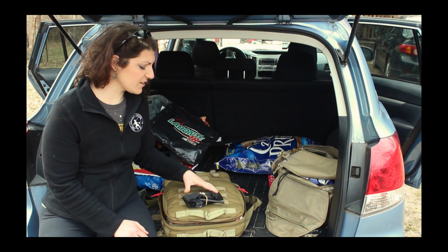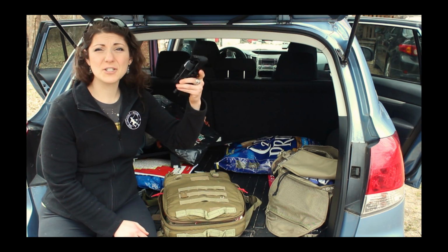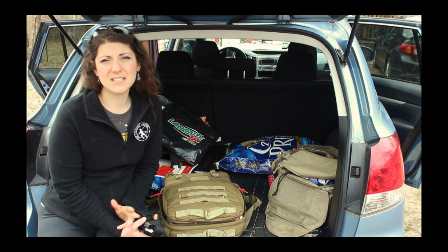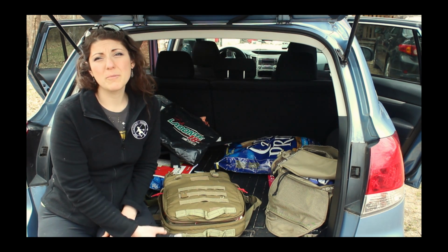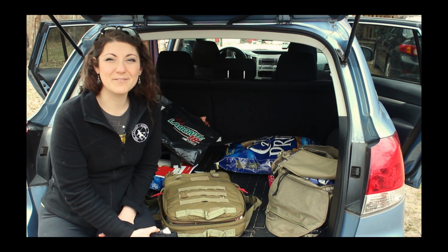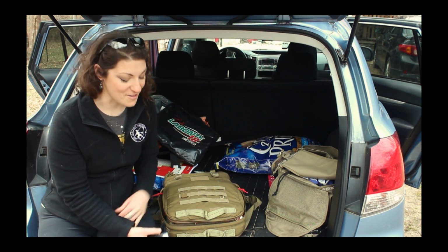The tourniquet that I have here, that's featured here, is a CAT tourniquet, okay? There are different tourniquets, and there's a SOFT-T Wide. The CAT I roll with because to me it's the simplest to use under stress, and in the words of Kerry Davis, simplicity under stress is a good thing.